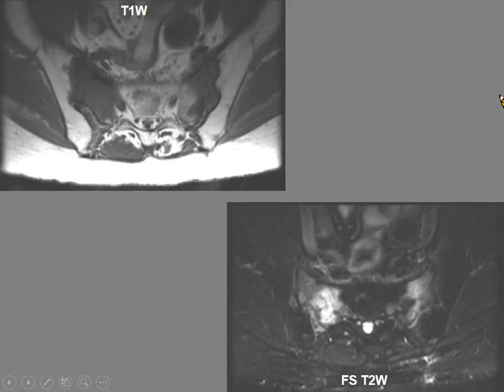And if you look at the marrow, it has the typical high T1 weighted signal that you see in a post-irradiated pelvis. And if you look at these lesions, it is not surprising that these were mistaken for metastasis. They have the classic appearance in that they have a low T1 weighted signal and a high T2 weighted signal, and on a background clinical setting of known malignancy, it is understandable when these are called metastases.